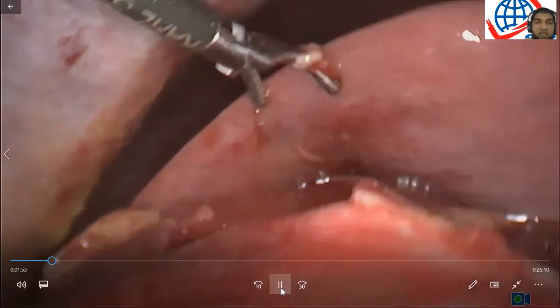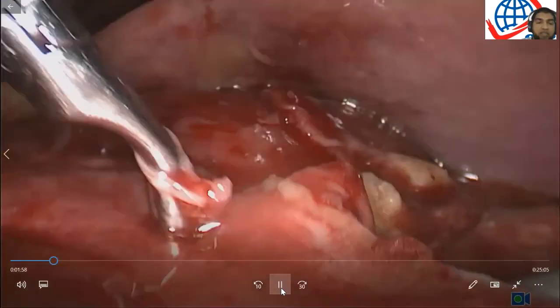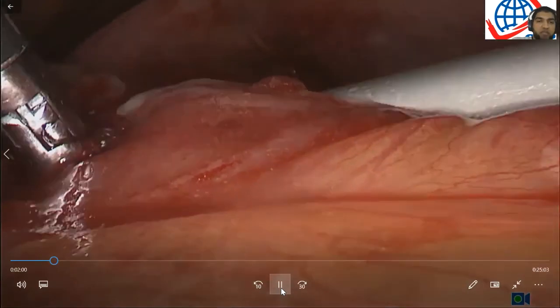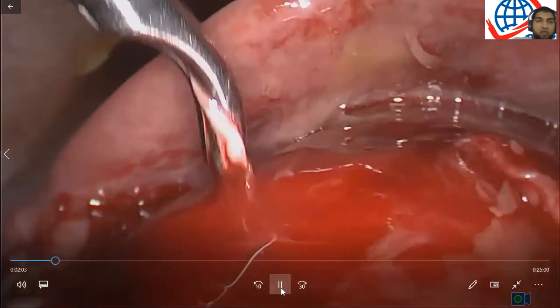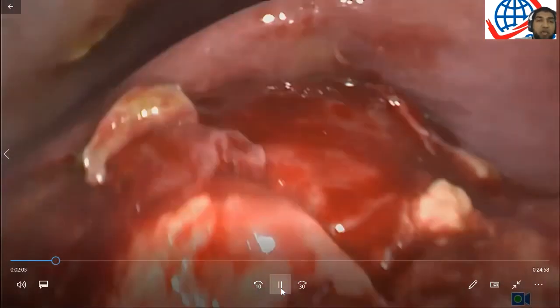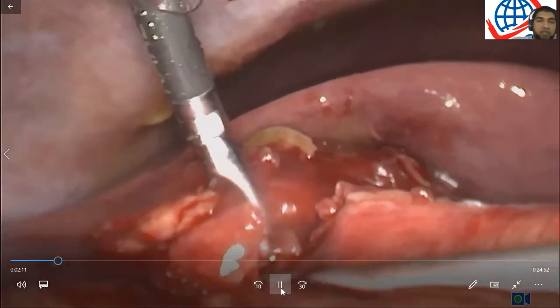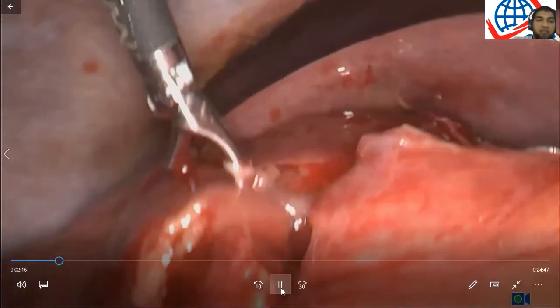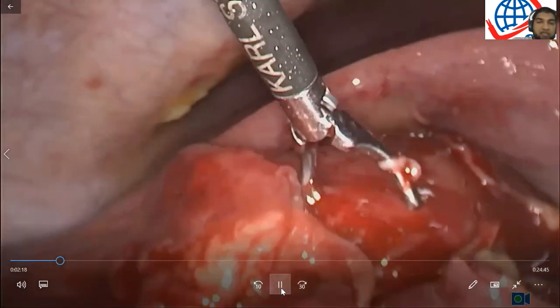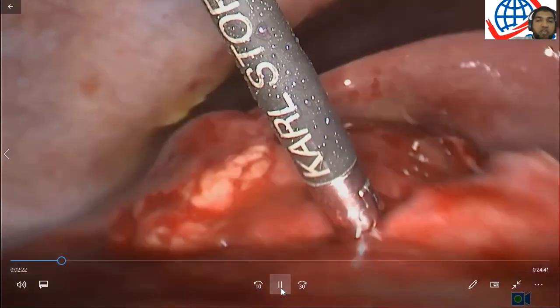Once you can see the gallbladder clearly, and you know that none of the surrounding structures are adherent to it, for example, the duodenum or the stomach, then you can put an aspiration needle in and you can decompress the gallbladder. Once the gallbladder decompresses, it'll be easier to grasp and it'll be easier to lift the liver and the gallbladder. That step will then help you to take you down slowly to Calot's triangle.